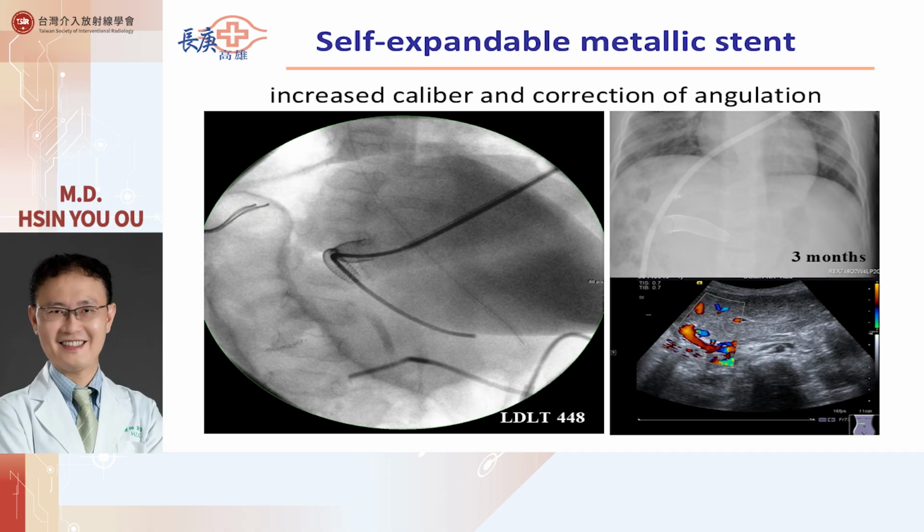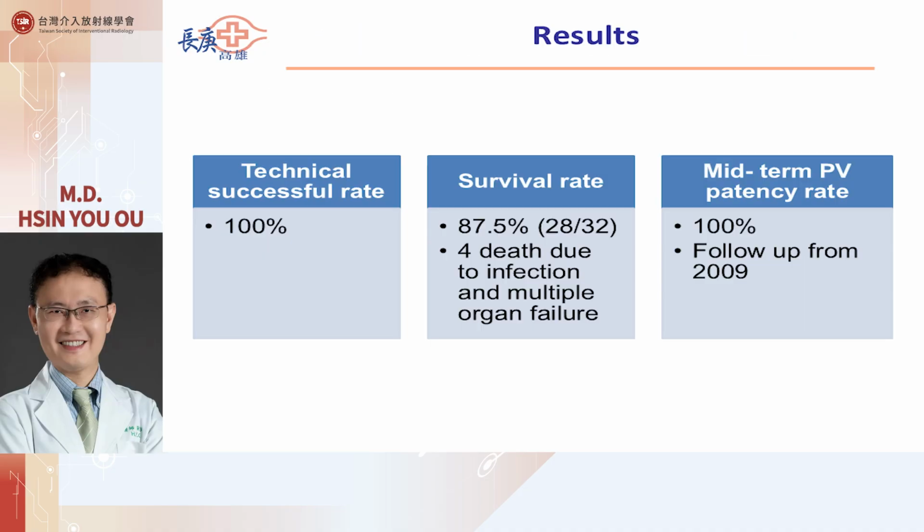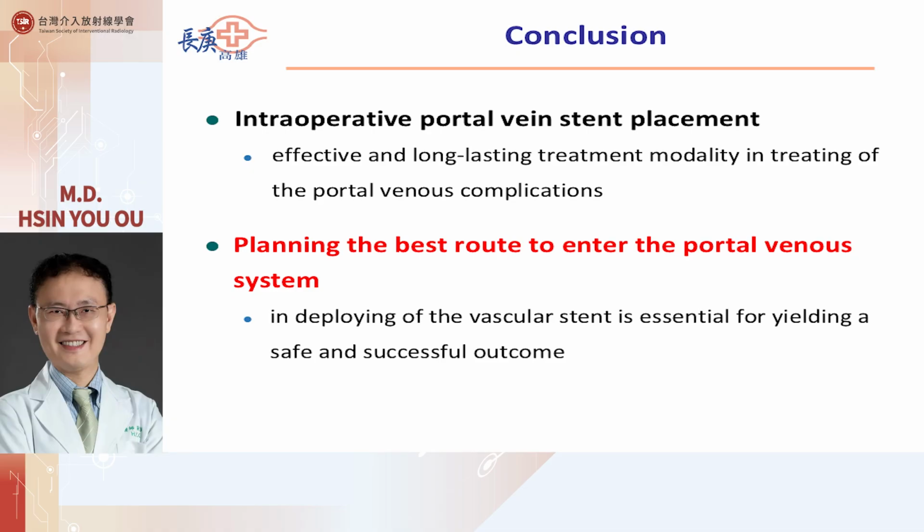For the long-term follow-up, the portal vein stent can be self-expandable, and we have followed patients from 2009 until now, with 100% patency rates. Of the 32 patients with intraoperative portal complications, 28 are still alive now. Our conclusion is that intraoperative portal vein stent placement is a very effective and long-term treatment modality for portal venous complications.